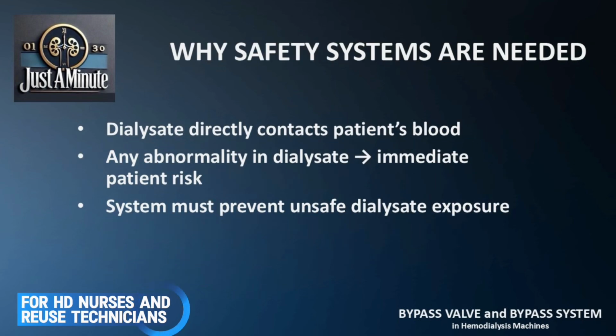Dialysate is in constant contact with the patient's blood across the semi-permeable membrane. Any abnormal dialysate, whether wrong composition, wrong temperature, or contaminated, can be dangerous. The bypass system was designed to prevent this risk.